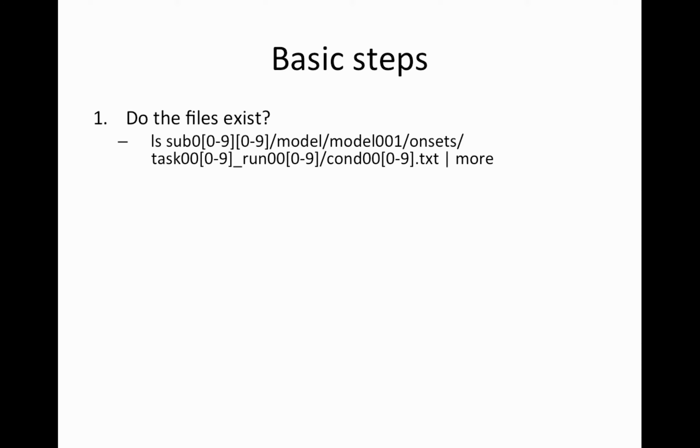And at the end, as I said, I'm going to put together a single document with all the steps and links to all the scripts. If I have to edit any of the scripts based on your comments, I will, so that at the end you have this nice little package of how to analyze your data, complete with scripts. And most of the scripts will be in Python.